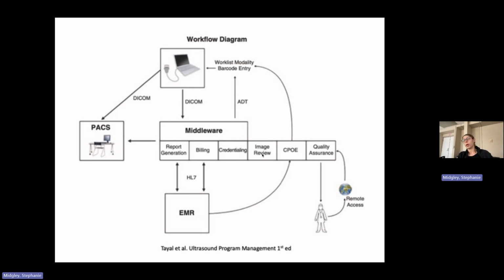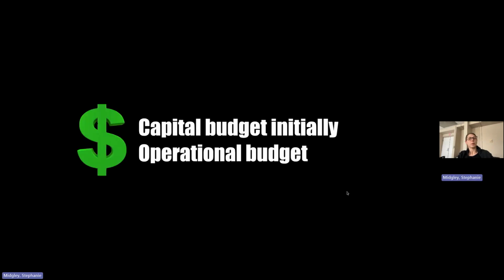Image review, so now you have your QA/QI right in there. And the other nice thing is that you can access it remotely, so you don't need to be on campus. The downside is that it's expensive.